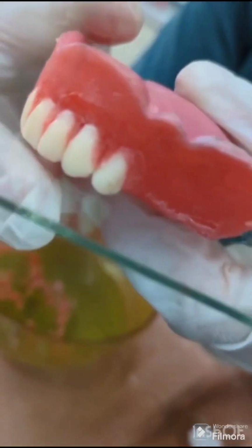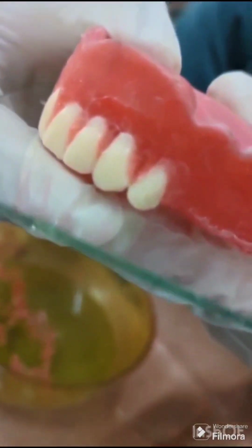After premolar arrangement on both sides, check the glass plate relation.